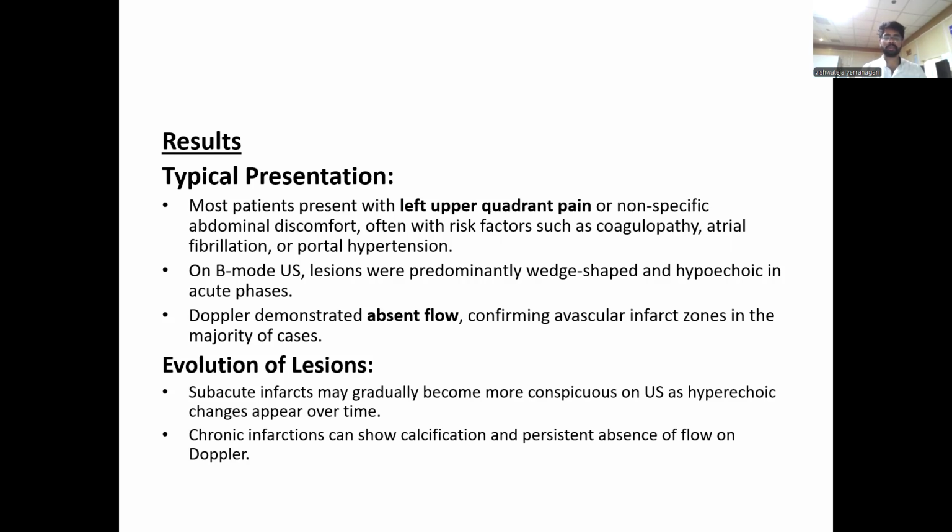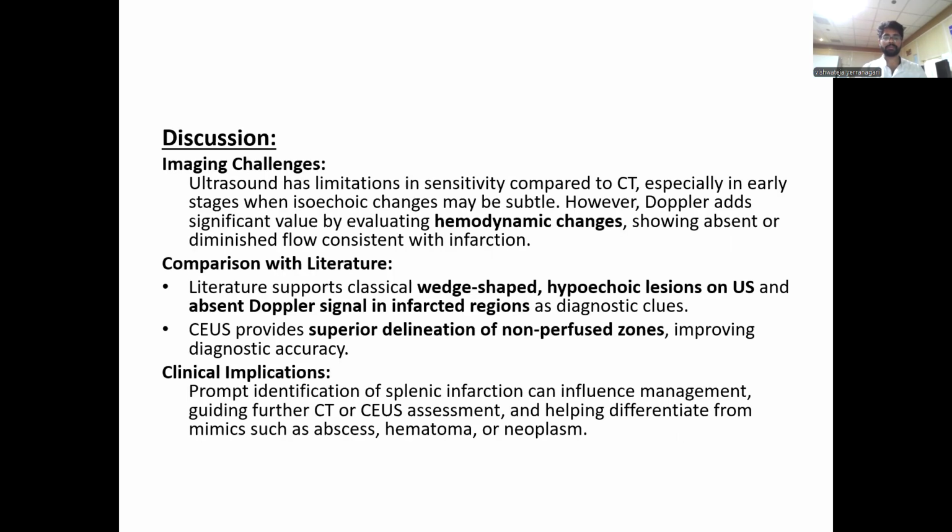Evolution of the lesion. Subacute infarcts may gradually become more conspicuous on ultrasound as hyperechoic changes develop over time. Chronic infarction may show calcifications and persistent absence of flow on color Doppler.